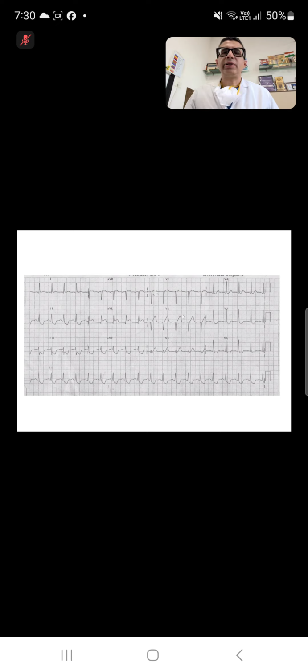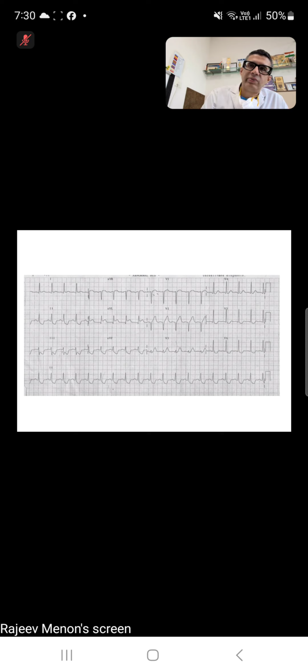So that means, say the patient has a right coronary artery that is supplied by collaterals from the LAD. Now the LAD has got occluded. So one, it has infarcted the LAD segment, and it has also reduced the blood supply by collaterals to the right coronary artery, so that area has become ischemic. So one, it's just reciprocal changes. Two, it is ischemia at a distance. Three, it is more than one territory where the patient is having ischemia. Generally, a patient who has a STEMI with reciprocal changes has a slightly worse prognosis than people who do not have reciprocal changes. So it has some significance.